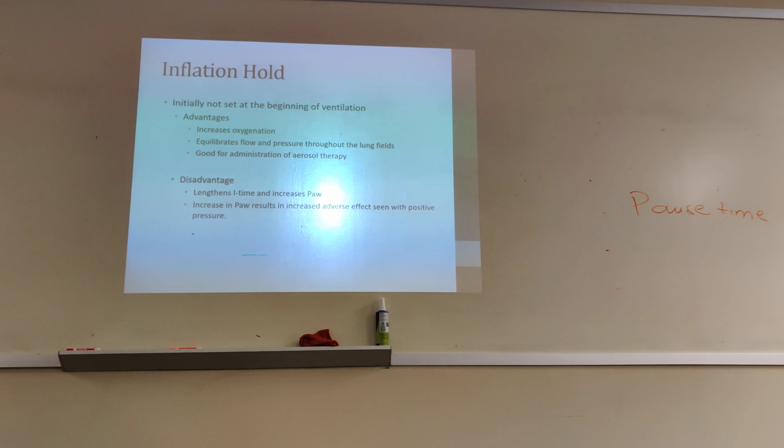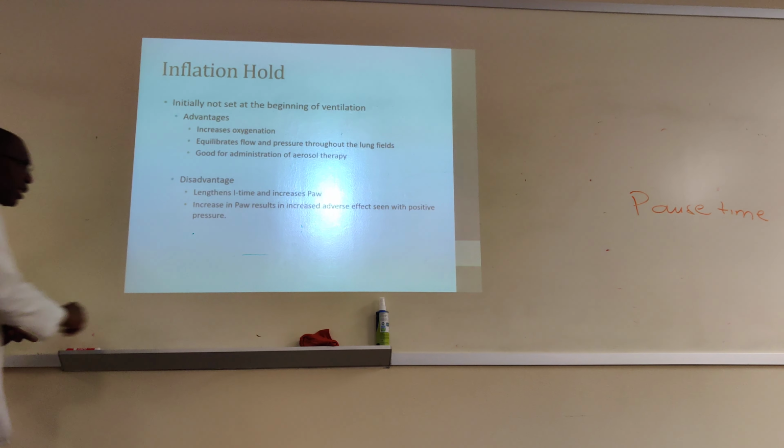It increases oxygenation. If you have your patient on the vent and you think they have enough FiO2, but the oxygenation is not going up, you can institute inflation hold. Anytime they breathe in, they hold it for a while. And this is the way it improves oxygenation.